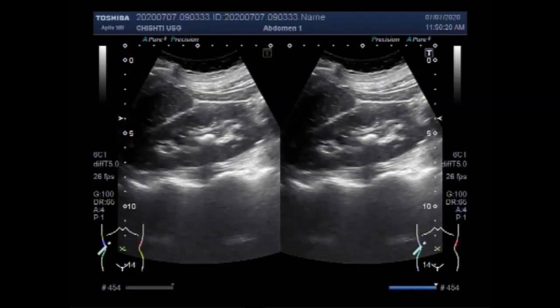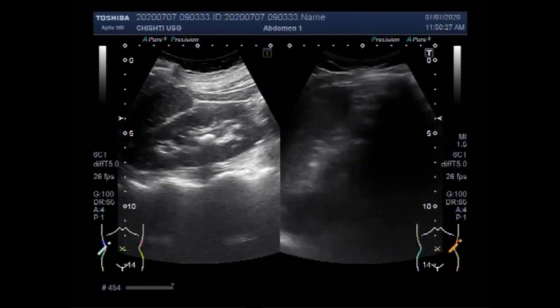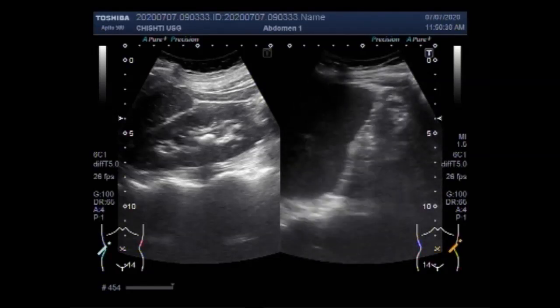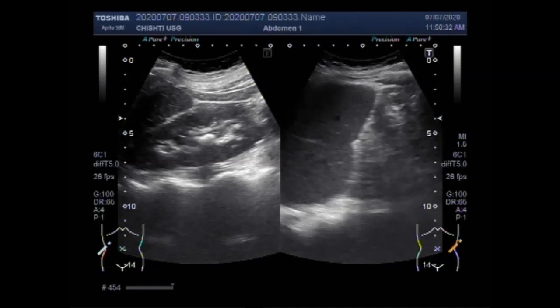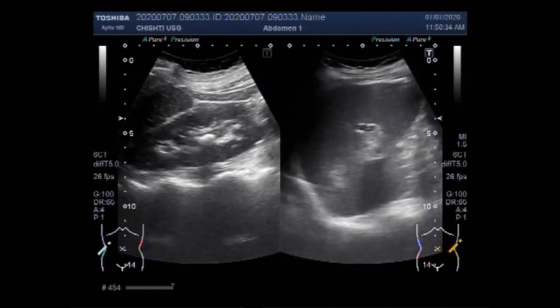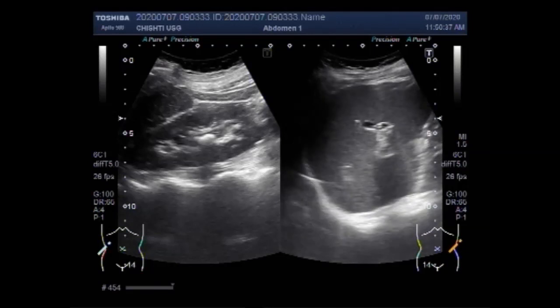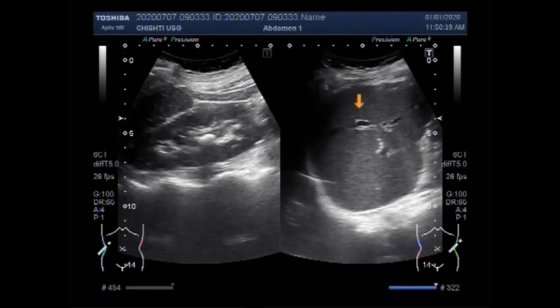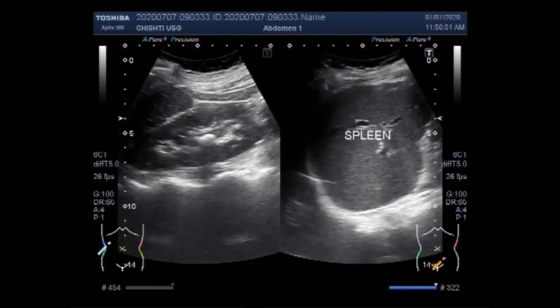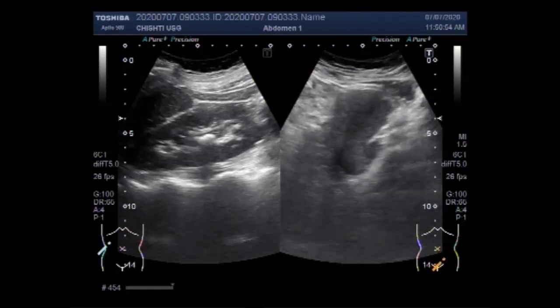Now you are going to see the left kidney and the spine. You can see the spine, but the kidney is missing from its normal anatomical position — it is ectopically placed. You can see the spine but the left kidney is missing from its normal anatomical position in the renal angle.